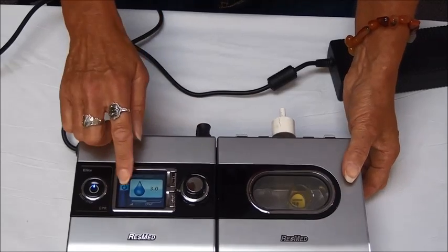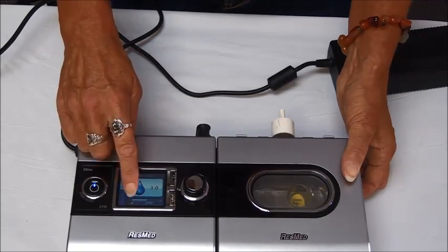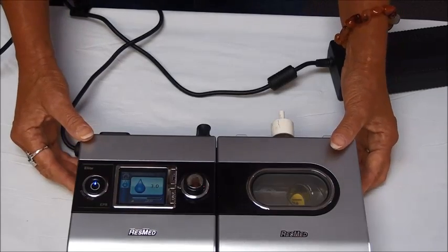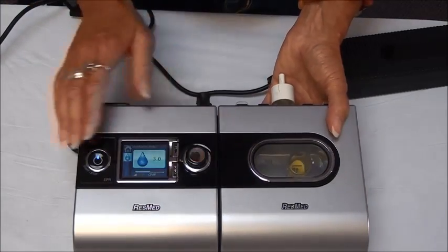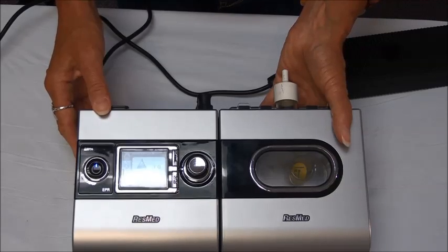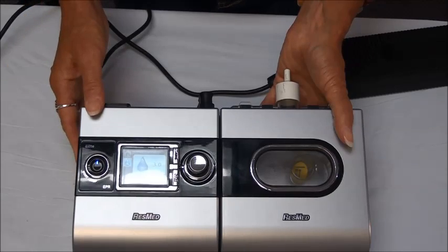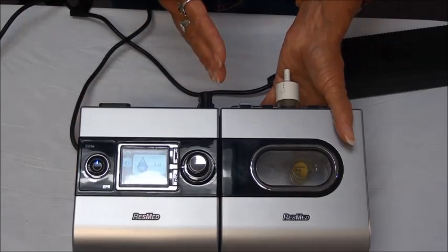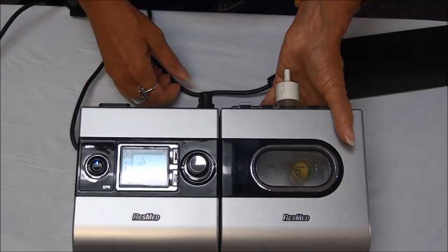At the bottom of the screen there's a smaller number and a little triangle. This unit has the ability to use a ramp or delay time, which is used as a comfort feature and can be set to whatever is comfortable for you. How it works is we set a pressure and a time limit — for example if we set a time of 20 minutes it would start at a lower pressure and then take 20 minutes to slowly work up to your set pressure.